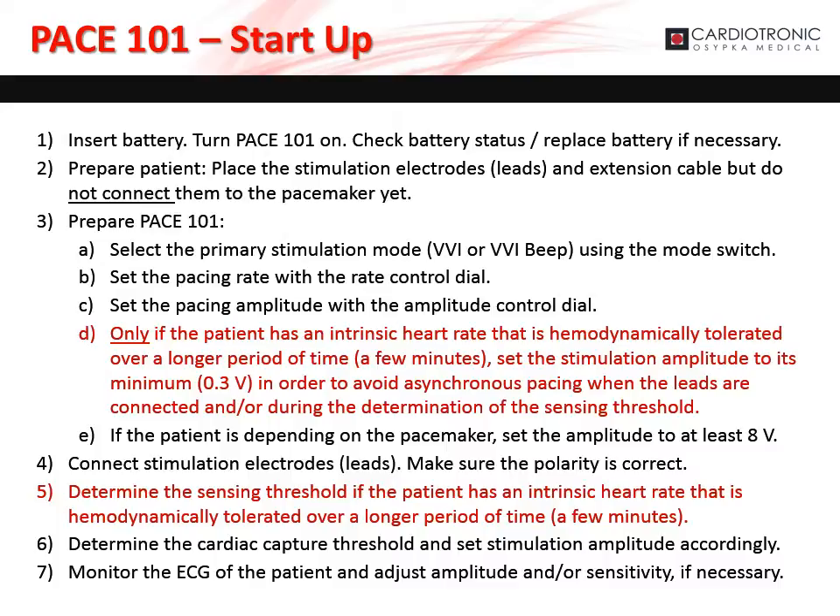Set the pacing amplitude with the amplitude control dial. If the patient has an intrinsic heart rate that is hemodynamically tolerated over a long period of time, set the stimulation amplitude to its minimum to avoid asynchronous pacing when the leads are connected and during determination of the sensing threshold. However, if the patient is depending on the pacemaker, set the amplitude to at least 8 volts. Now connect the stimulation electrodes to the pacemaker and make sure the polarity is correct. Determine the sensing threshold and capture threshold and set stimulation amplitude accordingly. Monitor the ECG and adjust amplitude and/or sensitivity if necessary.